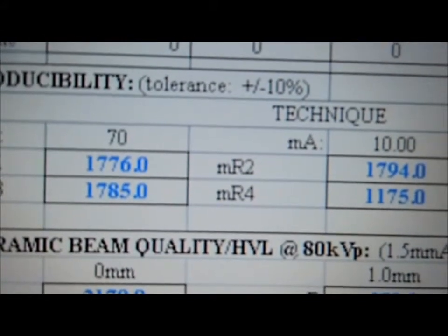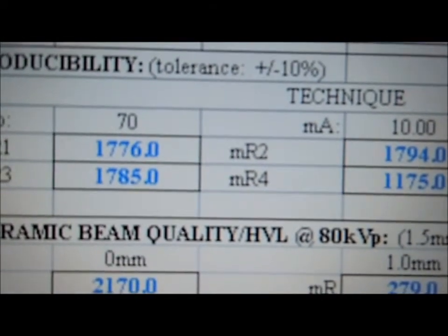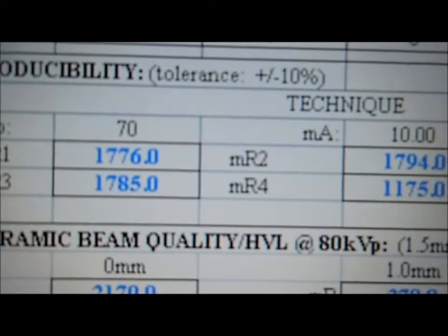Reproducibility. This is measured non-invasively with a QA meter, panoramic, and X-ray device control techniques set at preset timing.